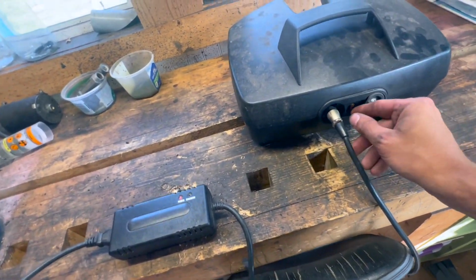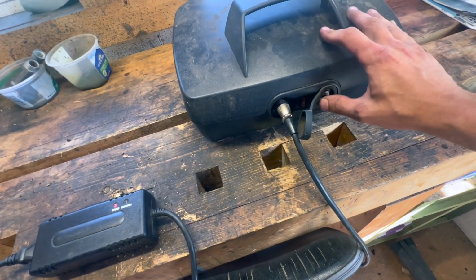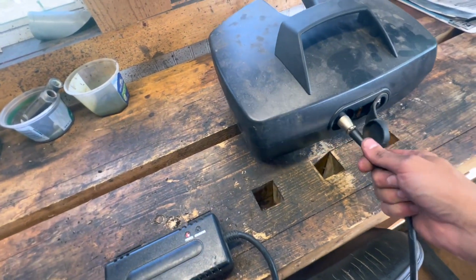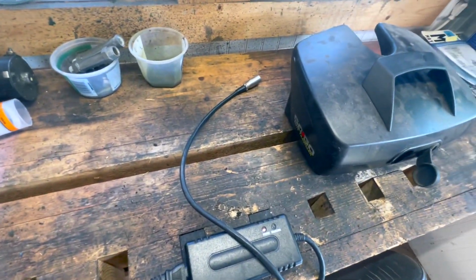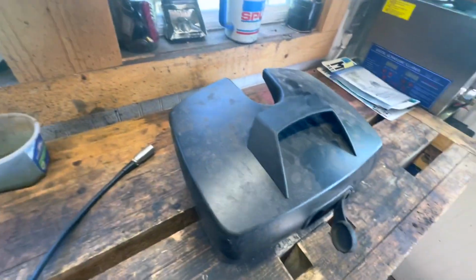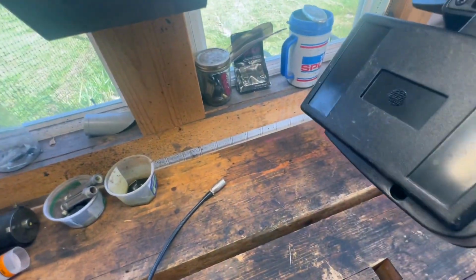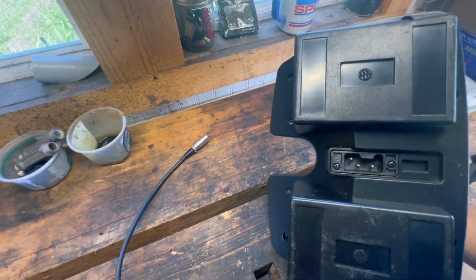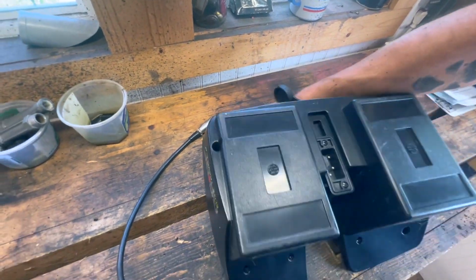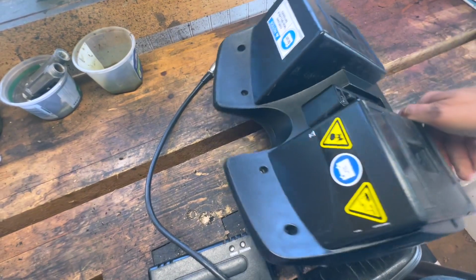I'm not sure why. There is a fuse here. I did pull that out. It's good. There's continuity across. But I noticed when I was taking it out, it seems like the batteries are just flopping around in here. And I'm not sure what that's all about. This is where it connects to the machine.